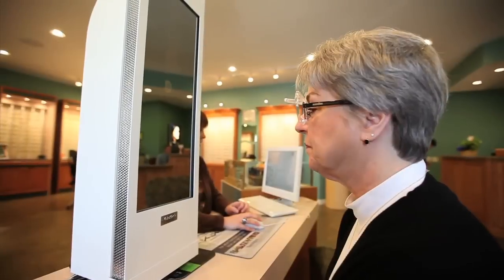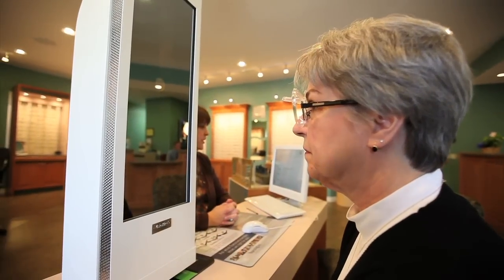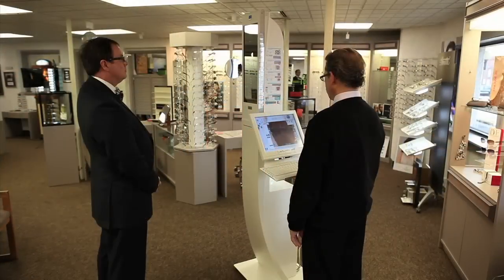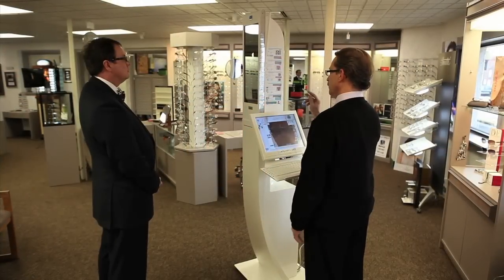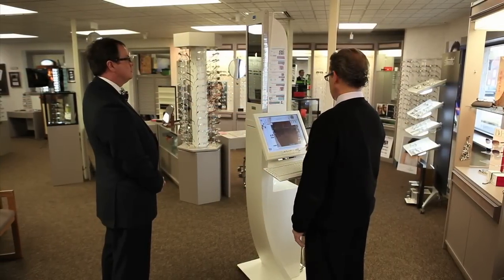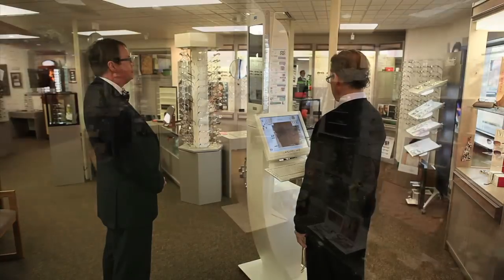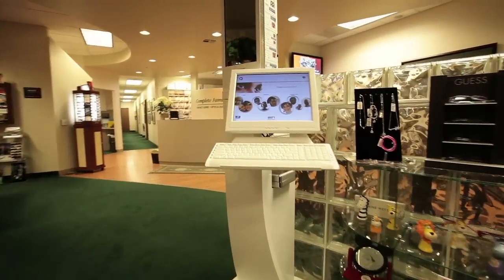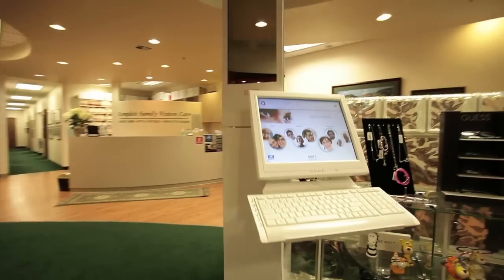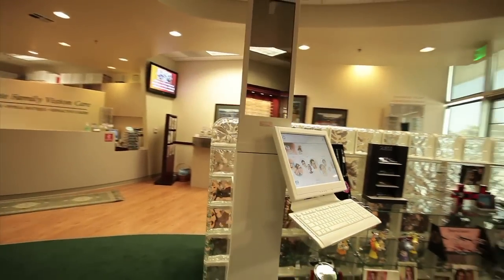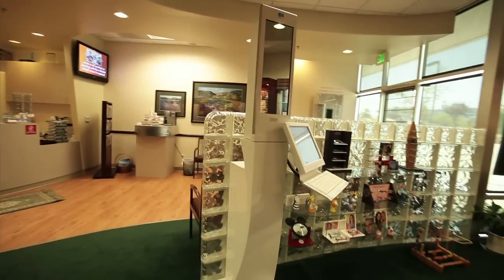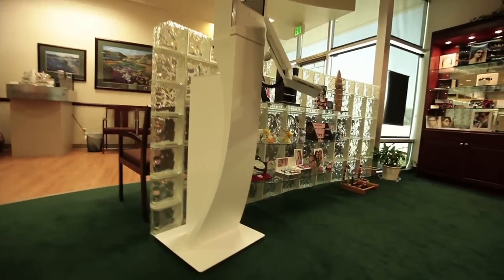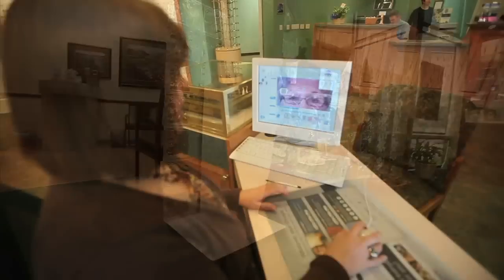The VisiOffice system is available in two models, the tabletop and the column, based on the preference of the individual ECP. The VisiOffice system can be located in any section of the dispensary and should be placed in an area that allows it to be a focal point in the dispensary.